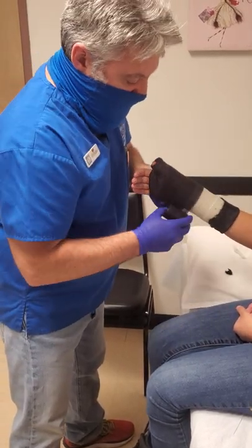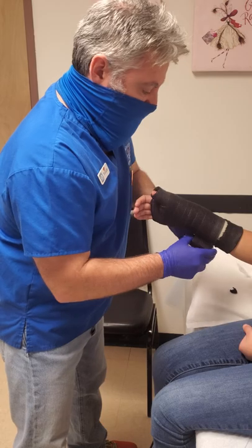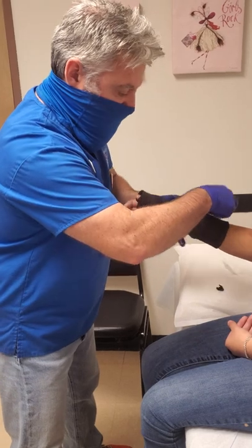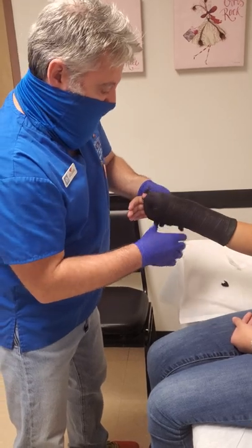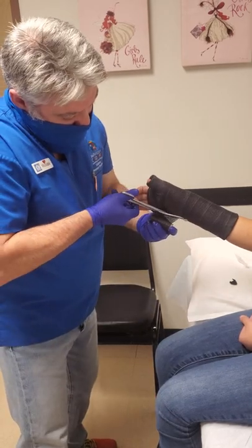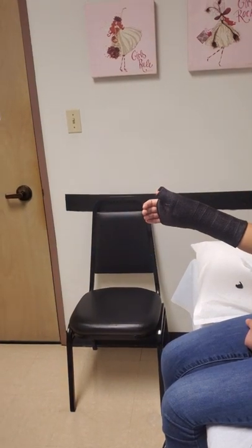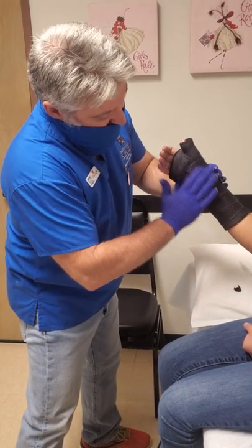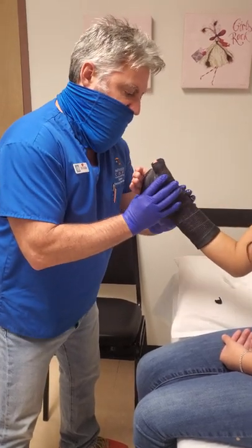The only thing I will do when I finish is make sure that as I work my way back up the arm, my last few turns are nice and wide so it looks nice and professional — and so if she wants her friends to sign it, there's plenty of room there. Try not to touch it — the black dye comes off. So then you get some lotion, soap, sanitizer, or surgi-lube and massage it in there to seal down that end piece, to get rid of that tacky, resin-y, sticky adhesive that you get on your gloves.